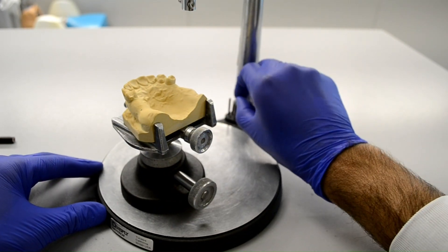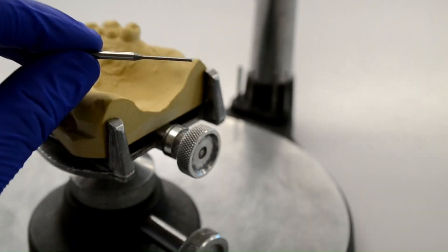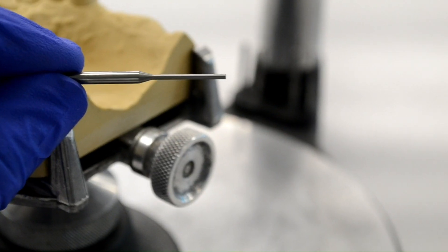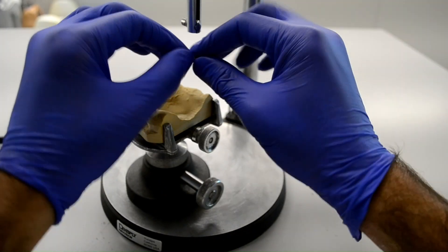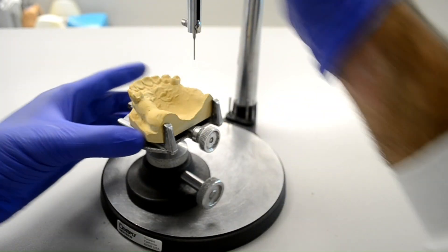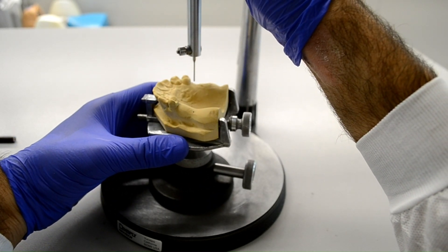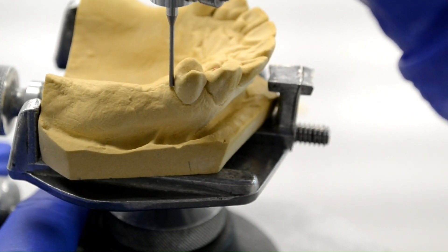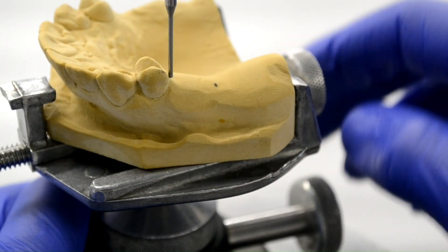The first step of surveying is to analyze the cast. This is done using the analyzing rod. We'll go ahead and put that into the mandrel. The goal of analyzing the cast is to identify a path of draw that would require the least amount of adjustment on the guide plane areas. The ideal path of draw would require even adjustments on all abutments rather than no adjustments on some abutments at the expense of the others.